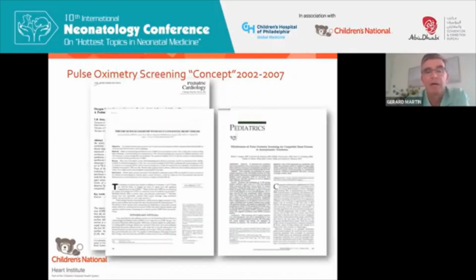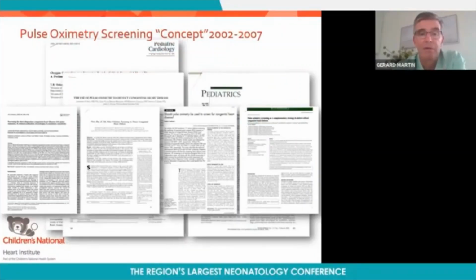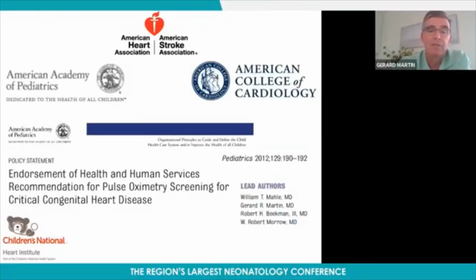Their paper was followed by a paper in Florida and in Long Island that also showed practical benefit to adding pulse oximetry screening. Unfortunately, for probably the next 8 or 9 years, the United States effort was lacking. Research really moved to Europe, in particular the Scandinavian countries, where some key articles identifying the problems around failed detection, the ability of pulse oximetry to add to the identification, and the sensitivity and specificity of screening really came to bear. On the basis of this strong European literature, the Secretary's Advisory Committee began to investigate pulse oximetry.